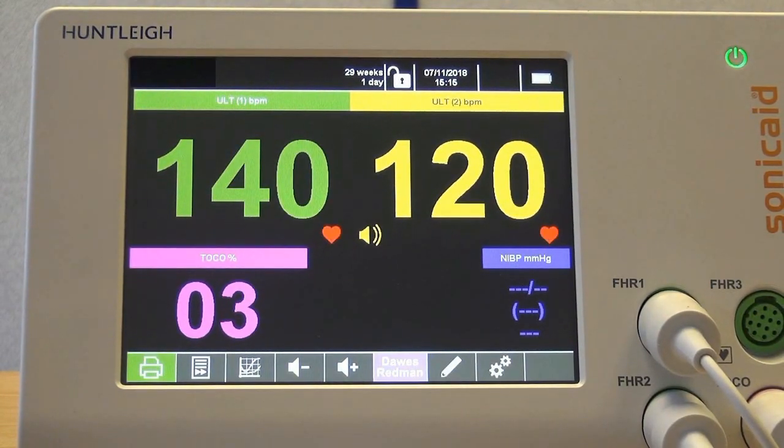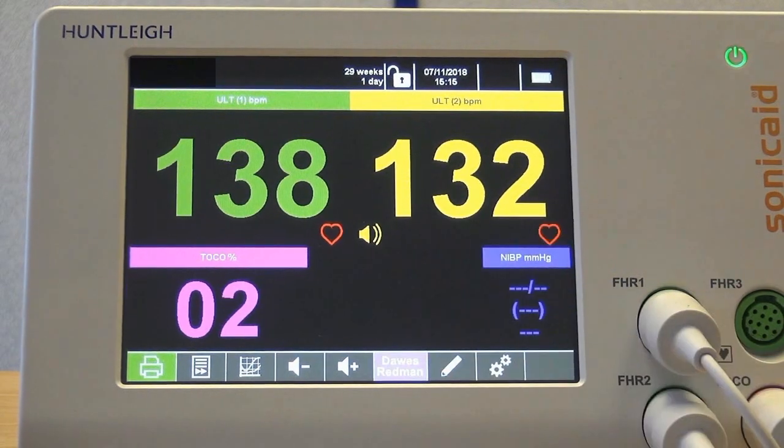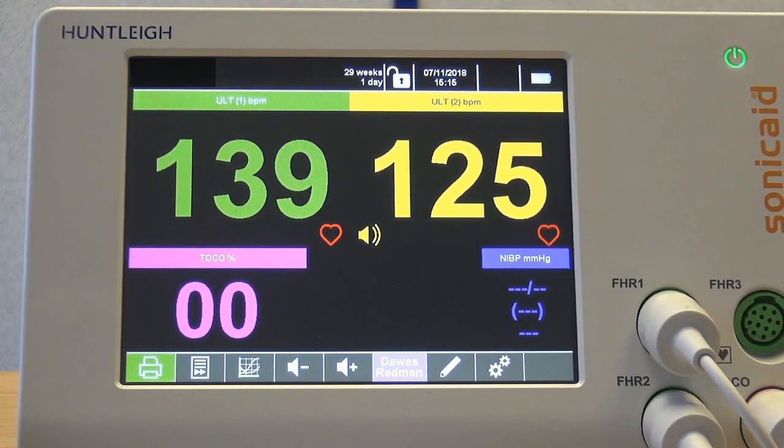Click the X to return to the home screen. The Dawes-Redman CTG analysis can now be run. The first result is available after just 10 minutes and can be viewed on screen. The results are also printed at the end of the trace.